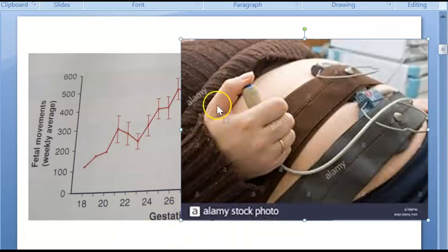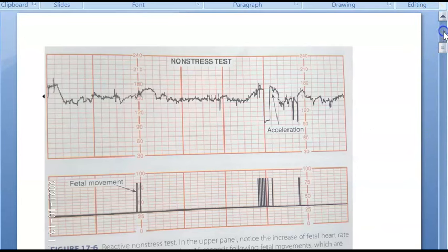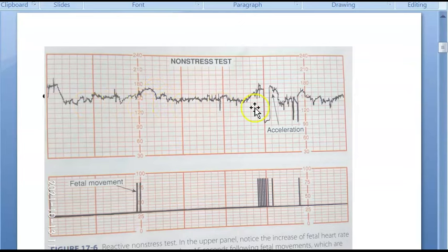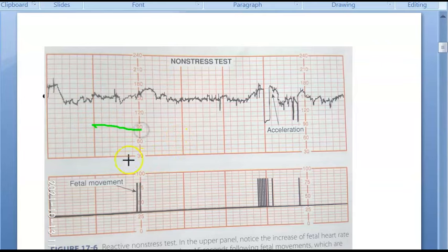Every time the mother perceives fetal movement she presses the button. If she presses at the wrong time you'd be expecting an acceleration that may not be there, which is why you focus on the score — checking the heart rate for two accelerations of the required change within the required duration. In 20 to 40 minutes, looking at the trace, each small box is about 10 seconds, so 6 boxes make one minute.